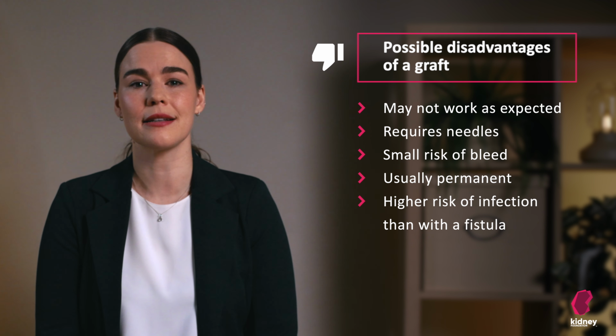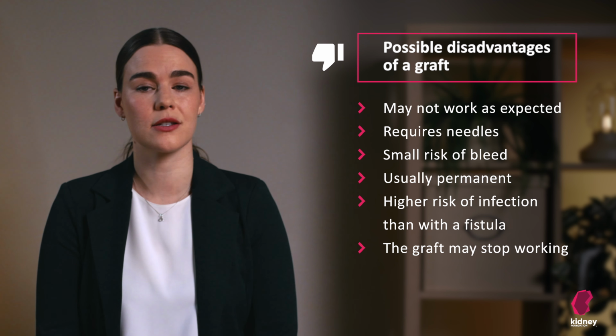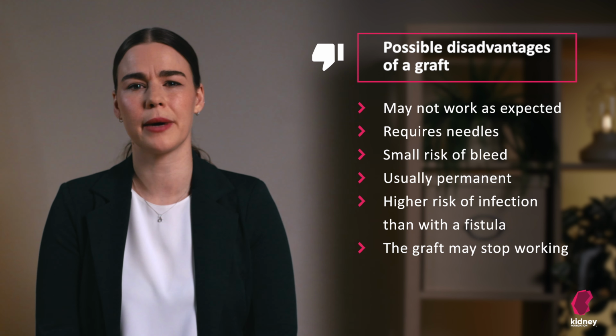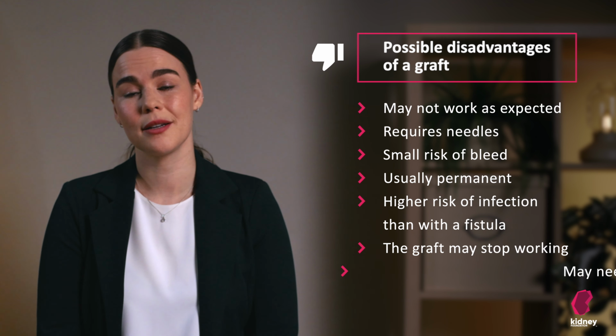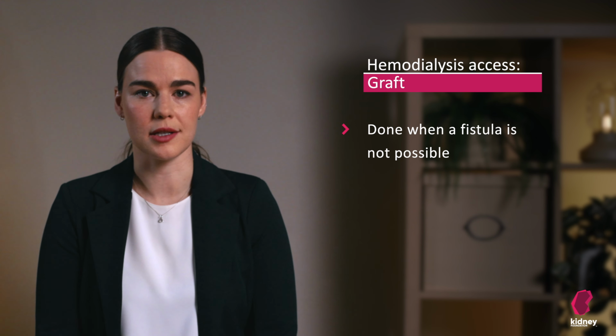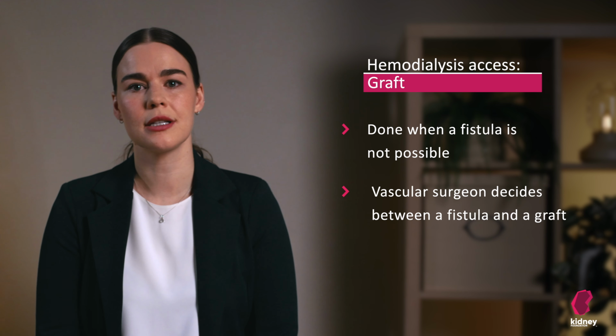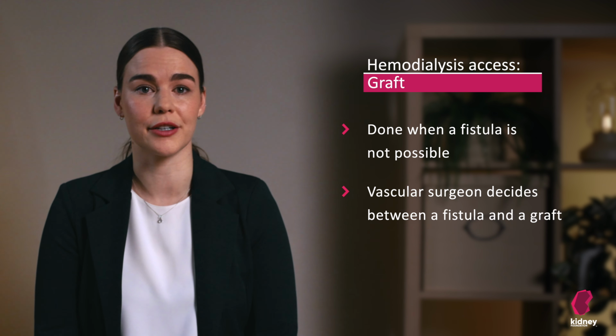if the graft gets infected, it can be more complicated. The risk that the graft may stop working increases after about a year and becomes greater than that of a fistula. Eventually, it may need to be replaced. A graft is done when a fistula is not possible. The vascular surgeon decides if a fistula is possible or if a graft is necessary.